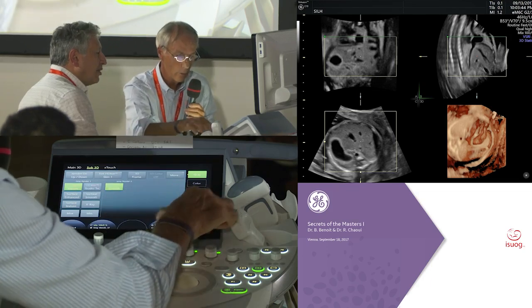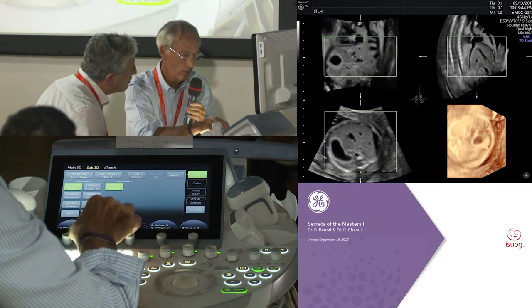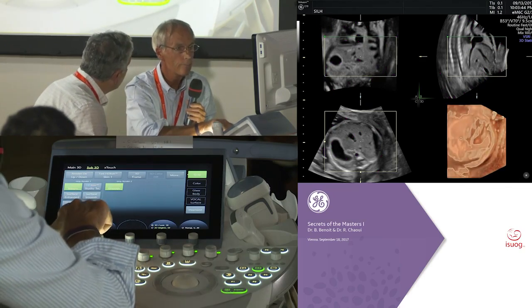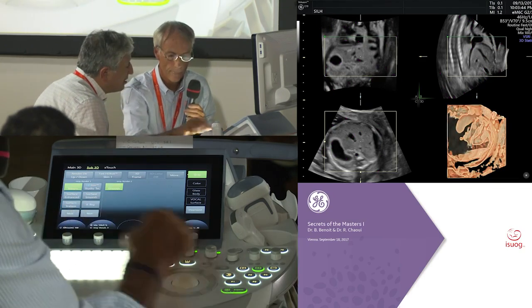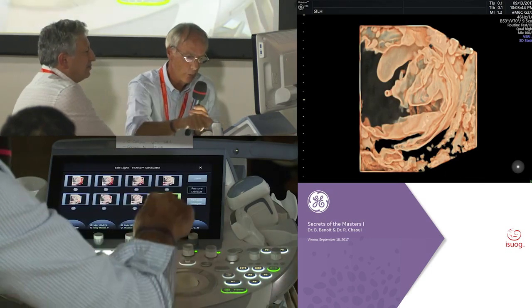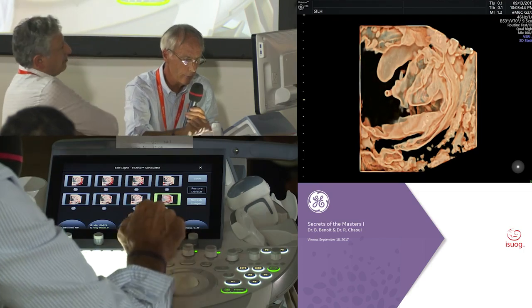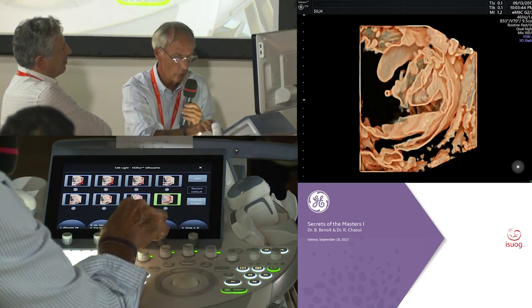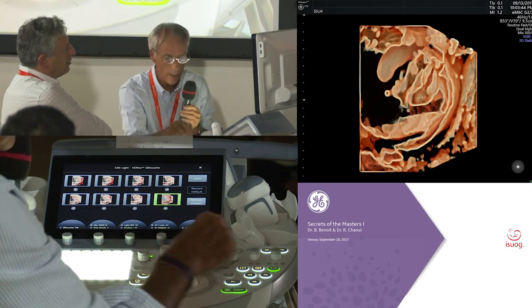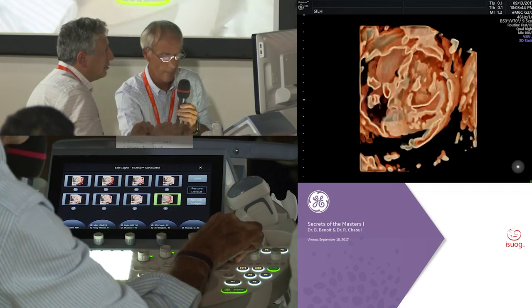And reduce transparency. 0 transparency, 0 threshold, high silhouette, 0 gain. 0 gain, 0 gray, 0 transparency. And what I have to do also is to increase the contrast and reduce the brightness. And shadow to 100. Wow. And now we move. We can see the heart. Turn. Yes.